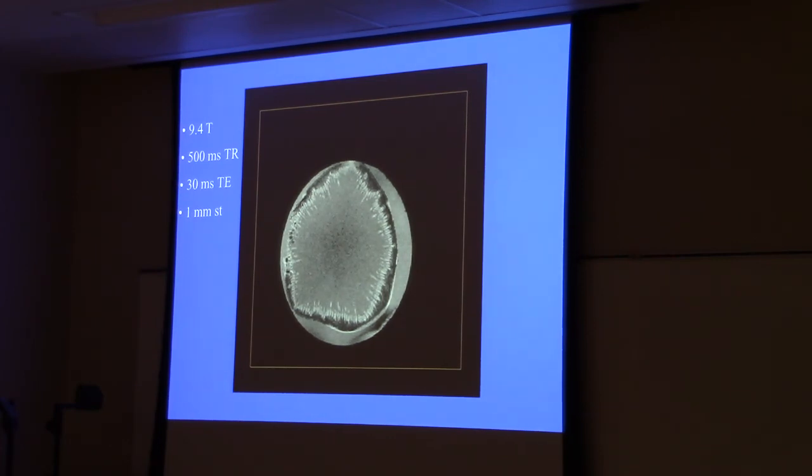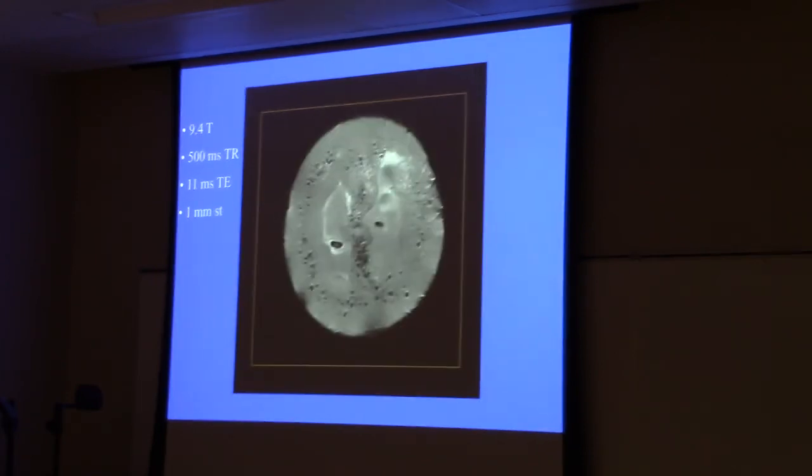Close. So the broccoli stem almost made it into my thesis. This little white ring at 9.4 Tesla is very beautiful and very wide, and it probably would have made it into my thesis if I was using a 9.4. But I was using a 2, and that white ring was just 1 pixel wide, so it didn't quite make it. A couple more.